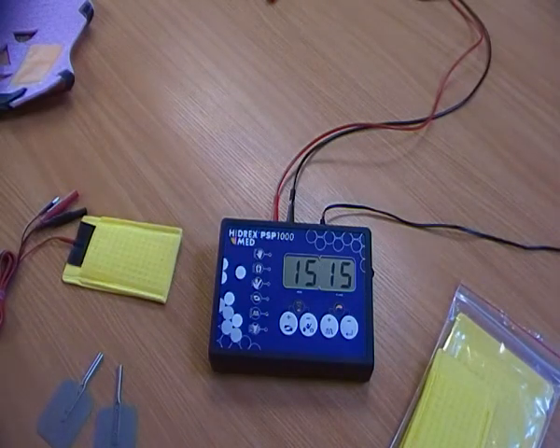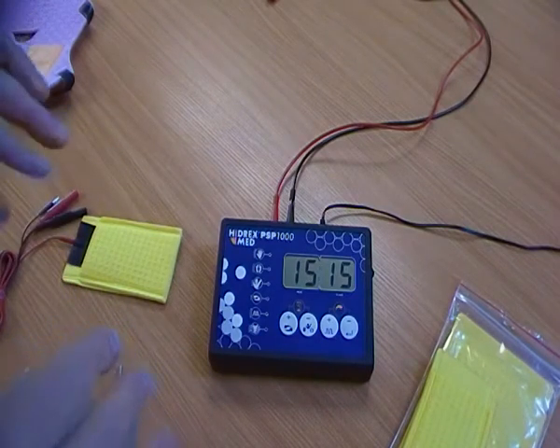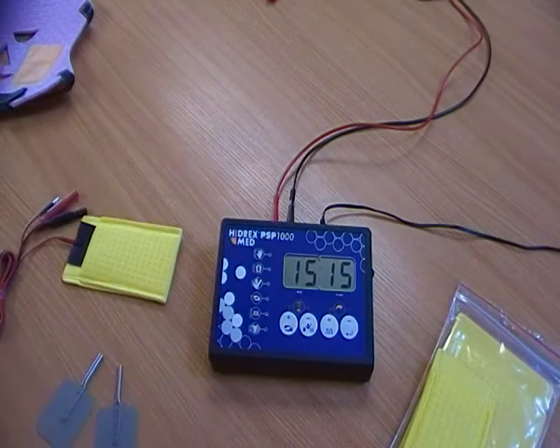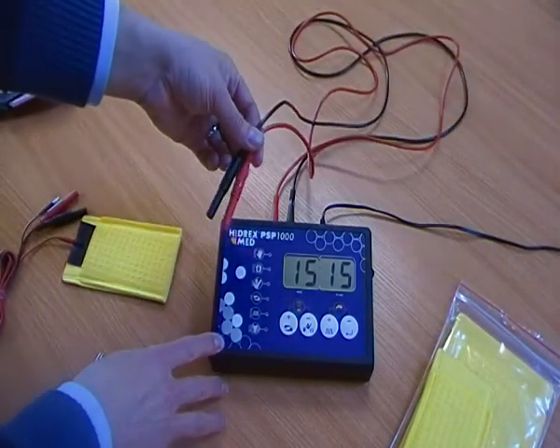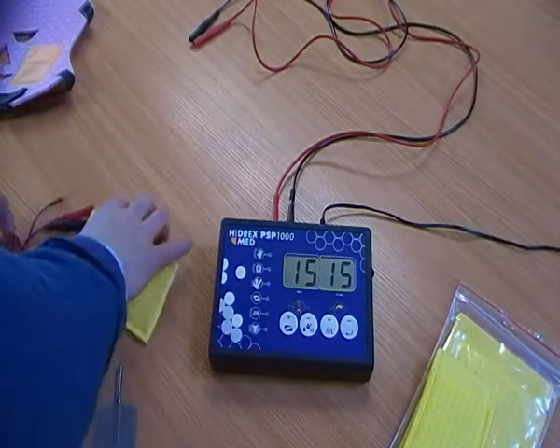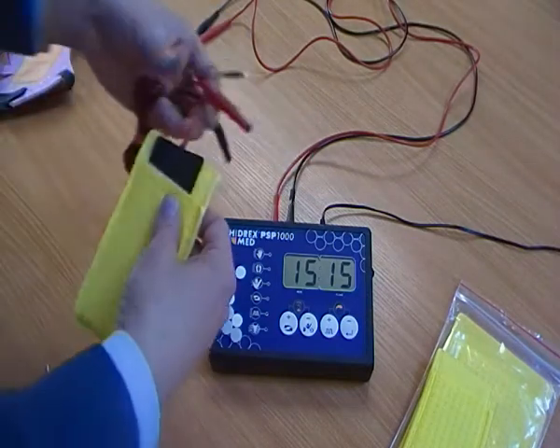Just a quick demonstration about some of the accessories that you get with the Hydrex PSP1000. These relate specifically to the flexible silicon electrode pads and the face mask. All machines are supplied with a standard set of positive and negative electrode cables. The flexible silicon electrode pads require a smaller cable, but the connections are obviously suitable for the control panel.